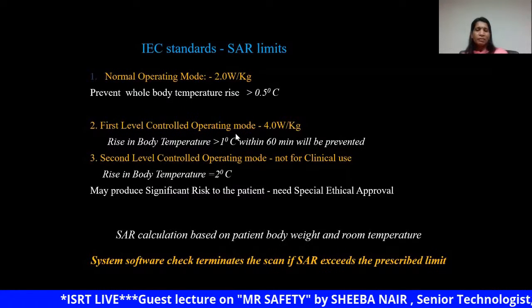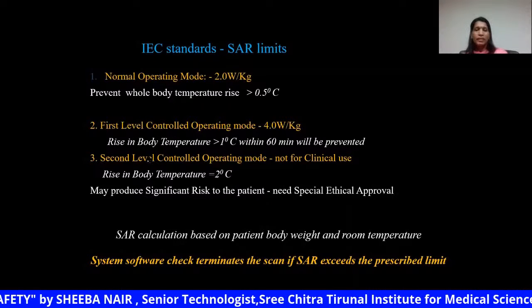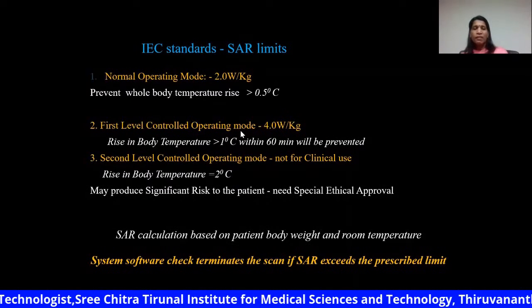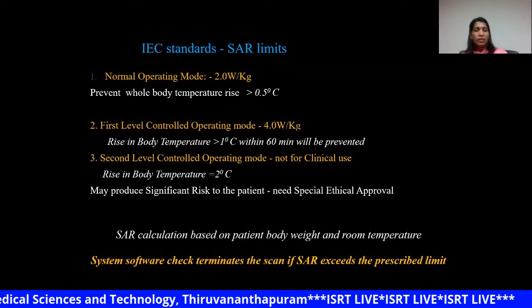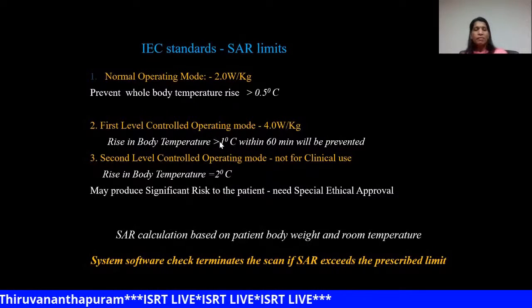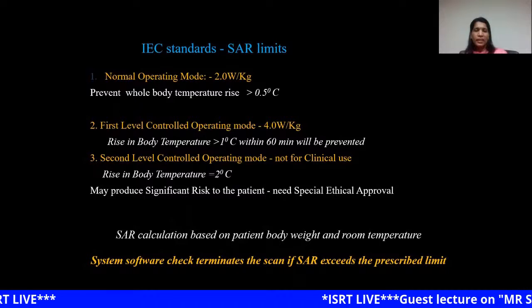But in certain pulse sequences, we have to enter into the first level mode. Especially the steady state sequences will work in the first level mode. In such a condition, the total energy deposition is permitted up to 4 watt per kg, and the system will terminate the examination when the body temperature increases above 1 degree centigrade.